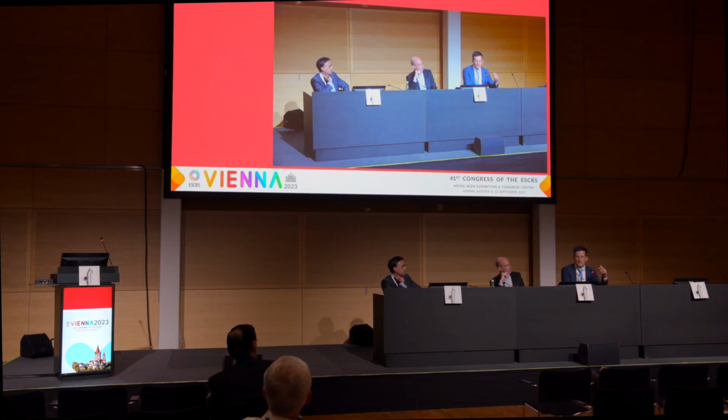Yeah, thank you. That is a very important point. With this type of lens, of course, centration and positioning of the IOL is critical for it to work well. When there is a movement of the IOL and the segmented optic comes closer to the optical center, then it could, of course, change the results. But in our impression, in our cases, we haven't seen any shift or any movement. But we're also only at 2 months now.